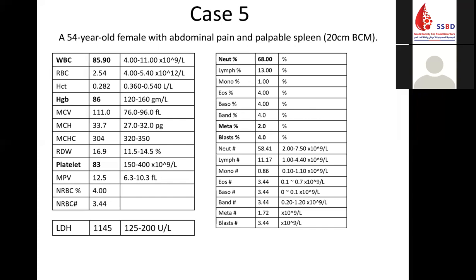And the leukoerythroblastic blood picture, by definition, is having left-shifted granulocytes up to the stage of circulating blasts, and also nucleated RBCs in the peripheral blood. So these patients have leukocytosis with the leukoerythroblastic blood picture. And from the laboratory, you would notice that the patient has a very high LDH. So: splenomegaly, high LDH, leukocytosis, leukoerythroblastic blood picture, adult patient.